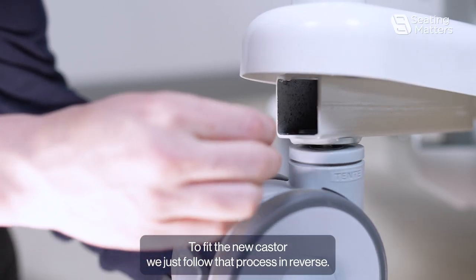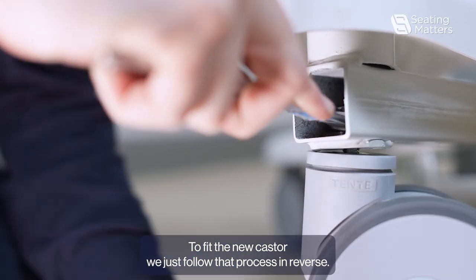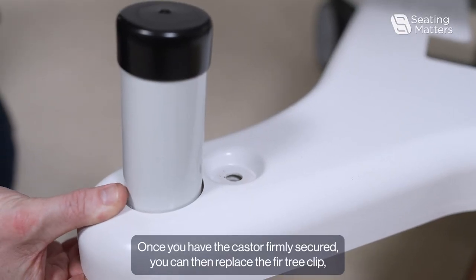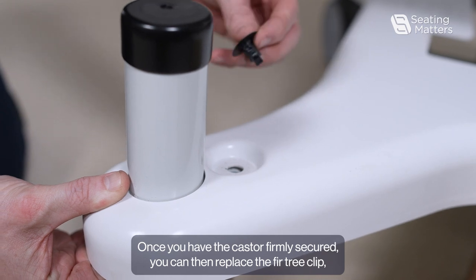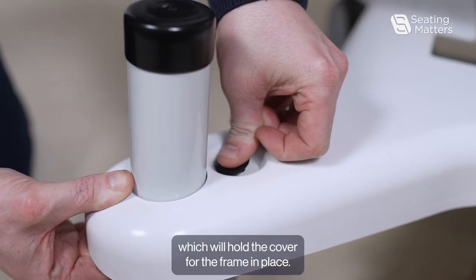To fit the new caster, we just follow that process in reverse. Once you have the caster firmly secured, you can then replace the fir tree clip, which will hold the cover for the frame in place.